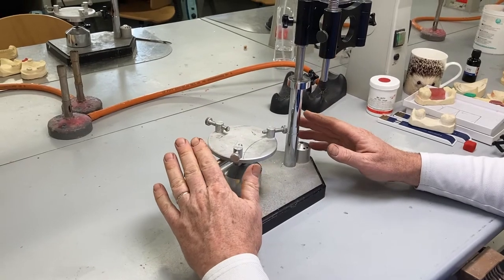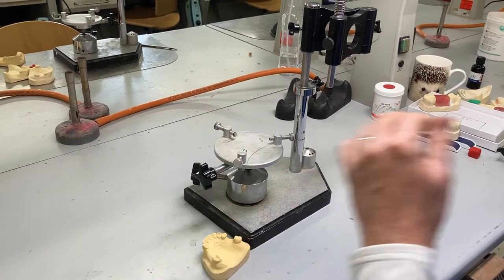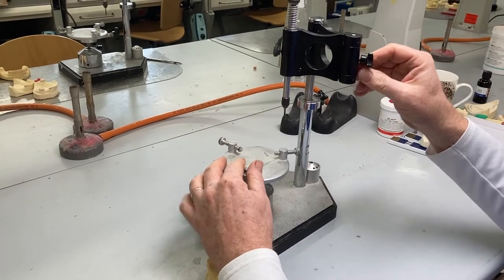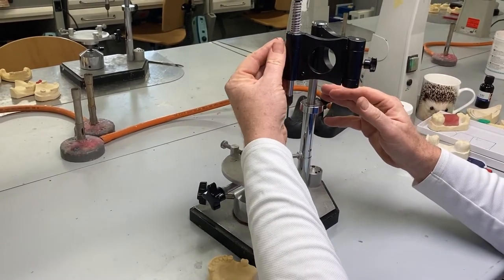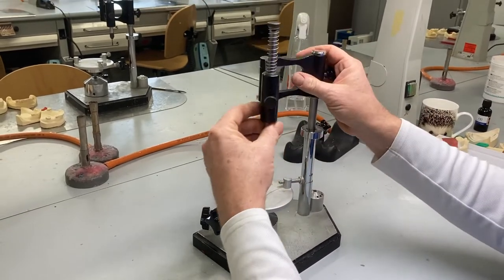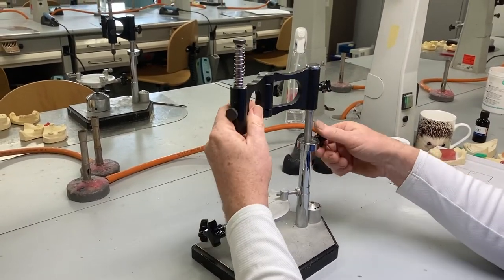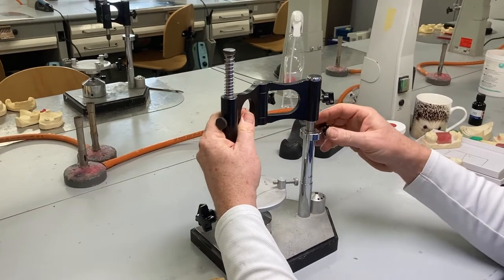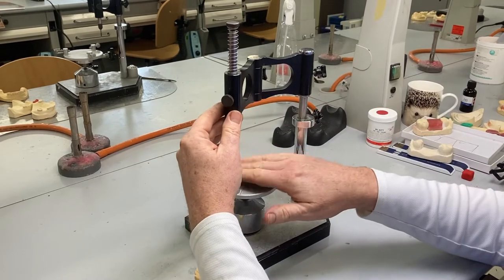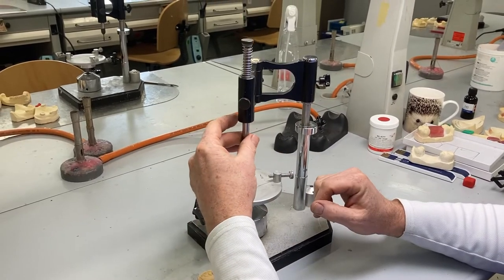This is what you need to be able to do with a surveyor. When you come to a surveyor to start with, you often find that when they've been stored, the surveyor arms are locked up. The first thing you need to do is just loosen the screws off by a quarter of a turn or so, so that everything is mobile. This one here adjusts the height of the arm, so sometimes you need to adjust that to enable you to get your model onto the surveyor table.